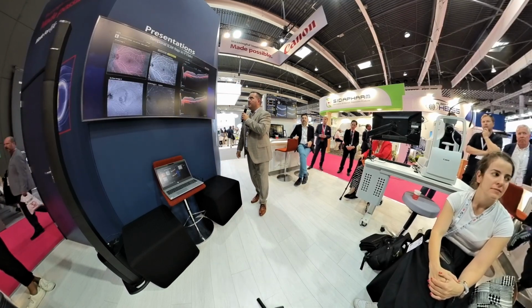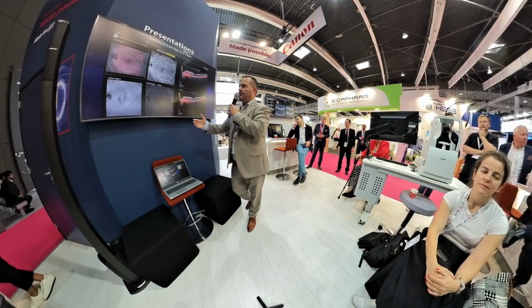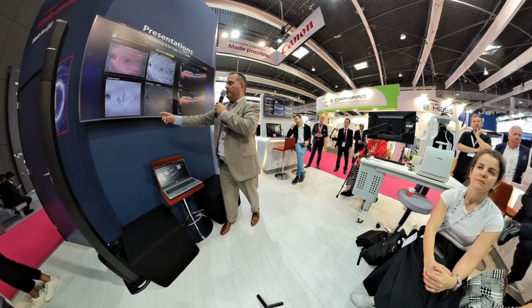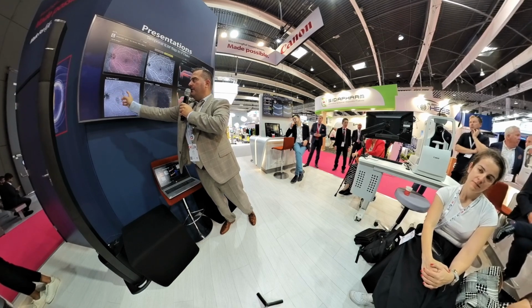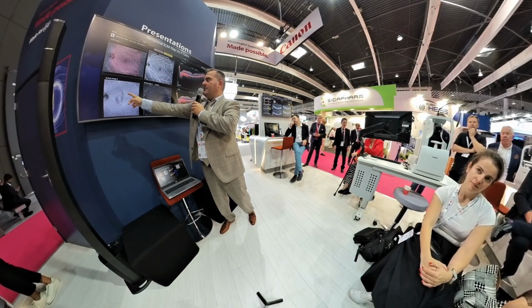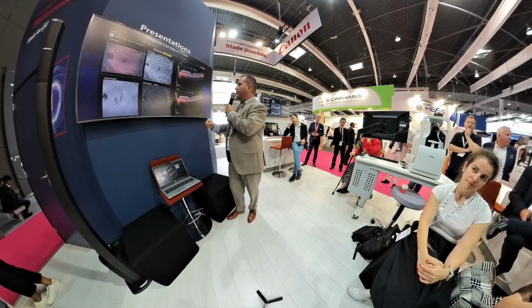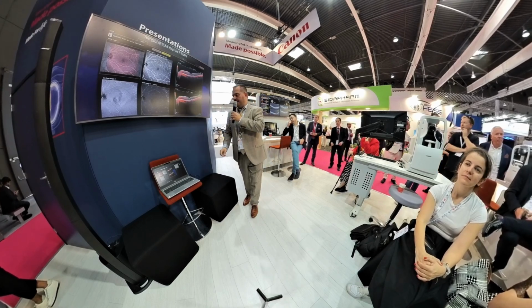This is a case with a temporal ILM flap, but a different fashion of flap. It is a multi-layered flap, and obviously one of the flaps is actually not covering the nasal side, but fortunately the hole is in the middle and it is well covered and the macular hole is closed.